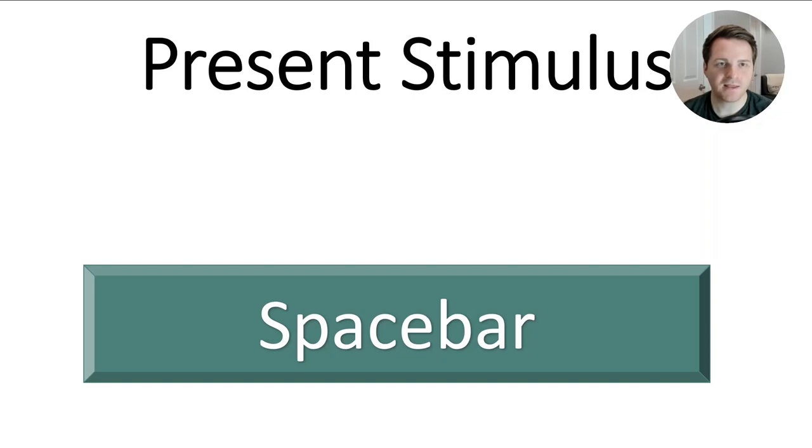The first shortcut is to present the stimulus. In the audiometer, you can hold down the spacebar to present the stimulus. Be sure to keep it held down for at least three beeps or you'll get a flag.